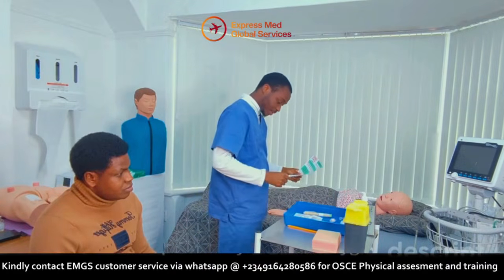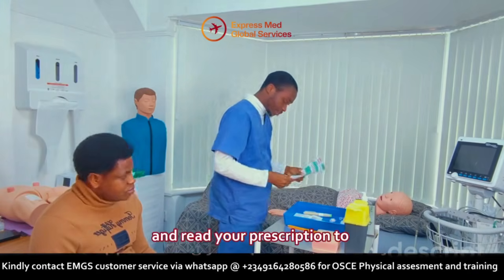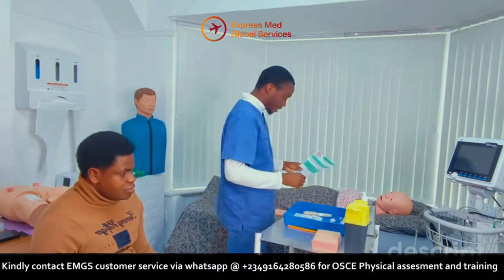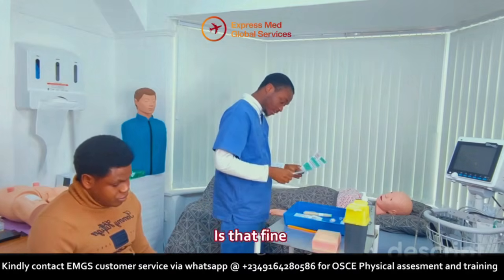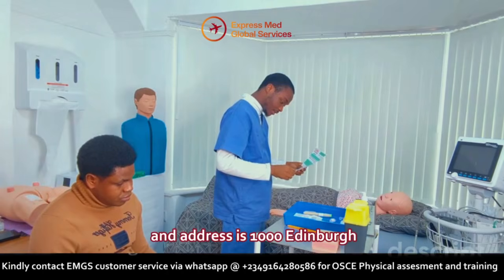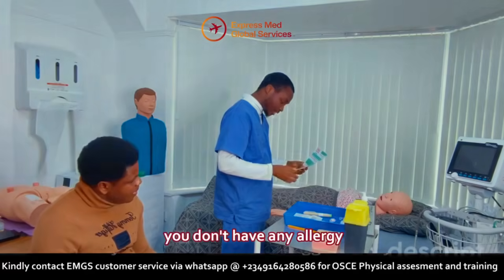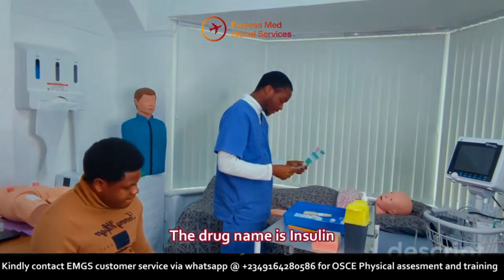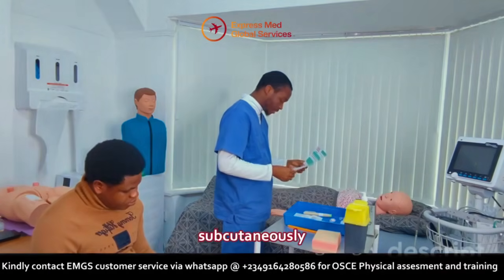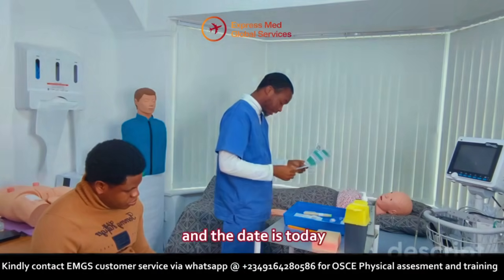Is that fine? Yep. Alright, thank you very much. So I'm just going to go ahead and read your prescription to be sure that it's valid, legible, and signed. I'm going to follow the rights of medication. Is that fine? Yeah. So I have here with me Miss Lady, and the address is 1000 Avenue. Your date of birth is 10/01/1987. Allergies, you don't have any allergy. The insulin dose is 15 units subcutaneously. The name and signature of the doctor is present, Dr. Jim Gray, and the date is today.